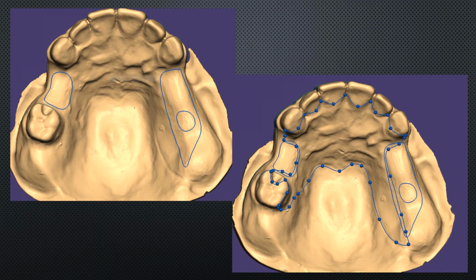And so if a doctor says, hey, I really want a tooth-borne, you got to explain to them, I'd like to see 1.5 to 2 millimeters deep and as wide as you can kind of go, encompassing that area. And that's tough. Sometimes you just can't. And again, I'm not here to say that a VisiClear frame or a Zerlux acetal frame is the solution for every possible situation. It's not. But the cool thing is you could add clear clasps to a metal frame. And if the doctor truly wanted a tooth-borne partial and couldn't afford to put some substantial rests on there, you can make a metal frame and process your clear clasps to it using the Hotshot gun or something like that.